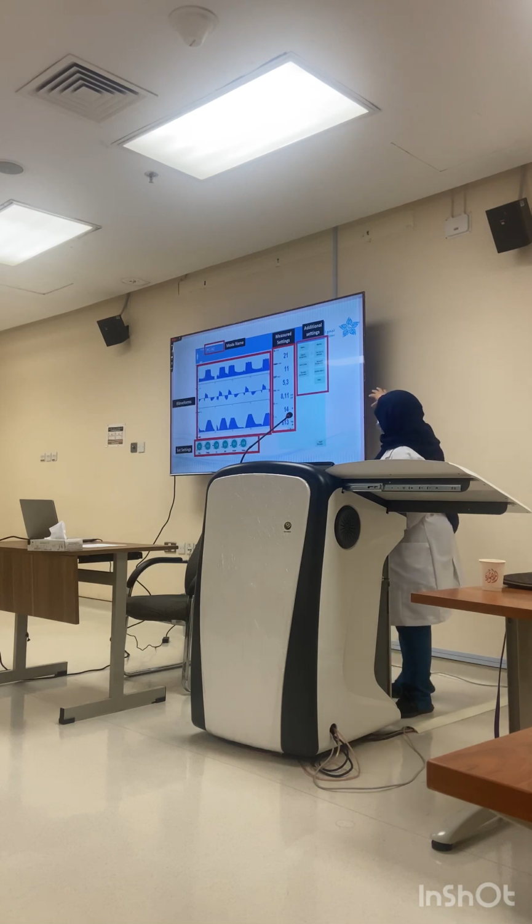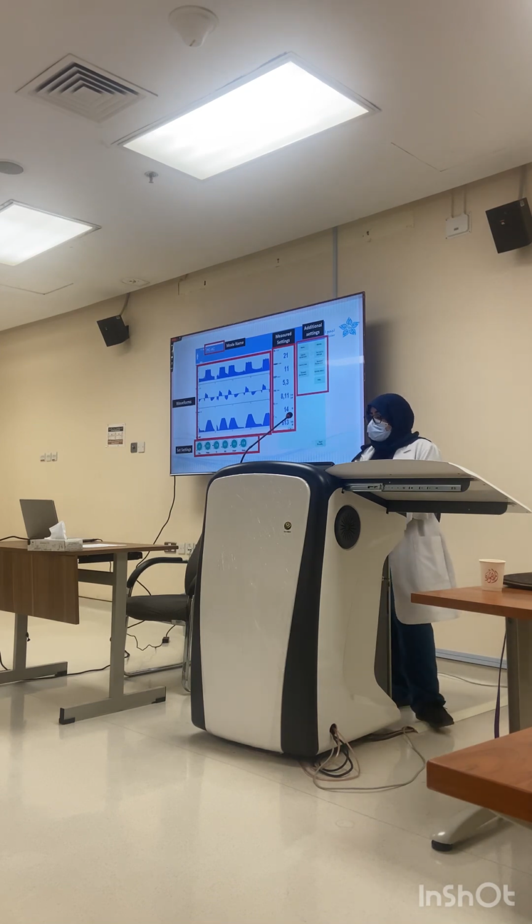The last here we have the additional settings. Additional settings are based on each company of the ventilator. So some companies will have additional settings for, let's say, expiratory parameters. They will put it here. Some companies will have nebulization settings. And it depends on the company of the ventilator. We're also going to see the alarm settings here, the ventilator changing mode. It's also in the additional settings.